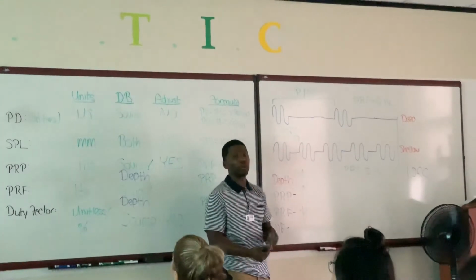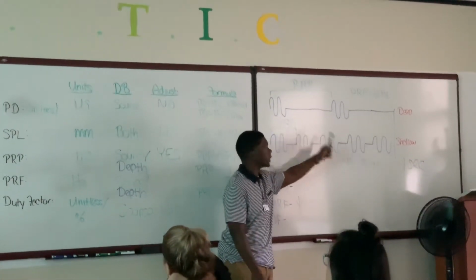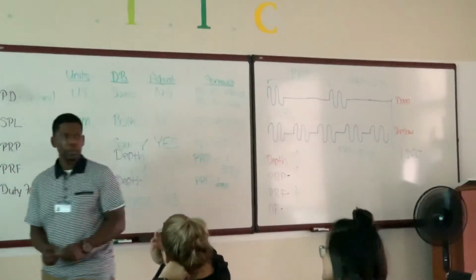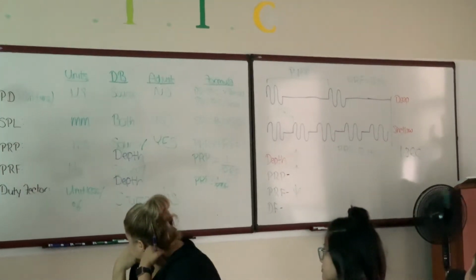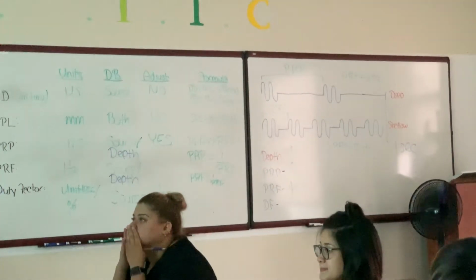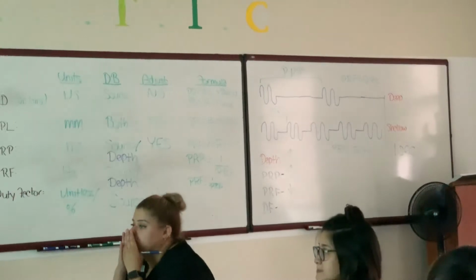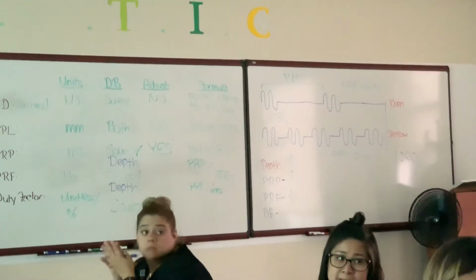Look how we transmitted a lot more times in shallow imaging than we do in deeper imaging. You can just eyeball that and see that it's transmitting more often. So our percentage is going to change based on that fact alone, right? Can you explain it again? The more the pulses, the more the duty time.